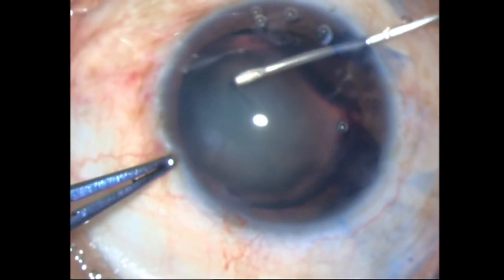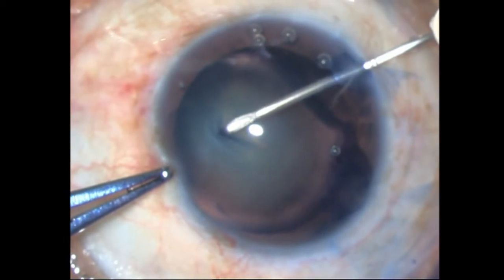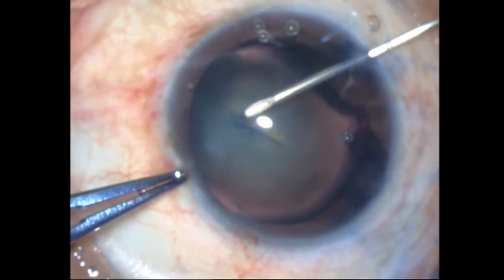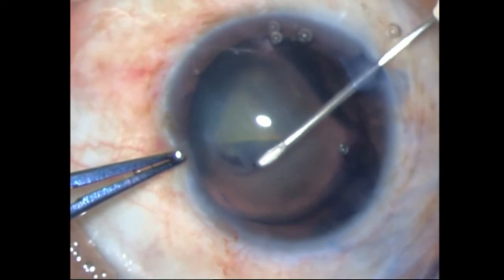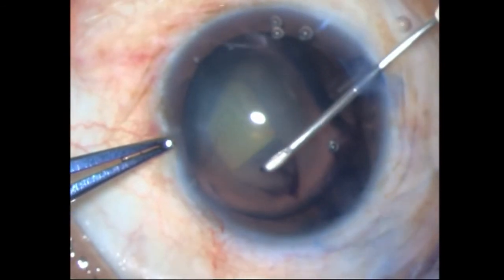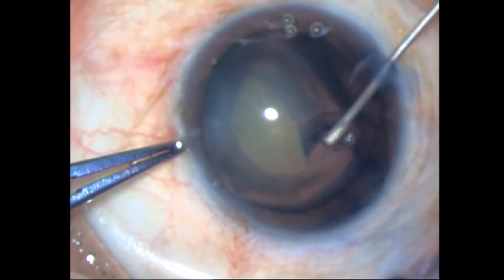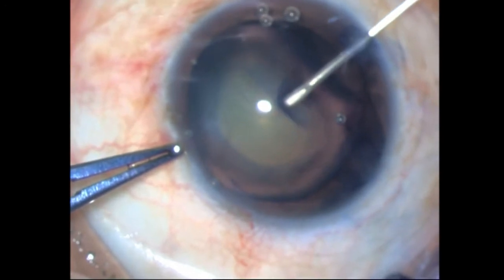You can see that the capsule is wrinkling quite a bit — that's because of the lack of inferior zonules. I'm going ahead and, with some effort, able to guide this capsulorrhexis edge in a circumferential manner. So far it seems to be going well. Notice carefully — I am always placing the tip of my needle right close to that capsular edge.